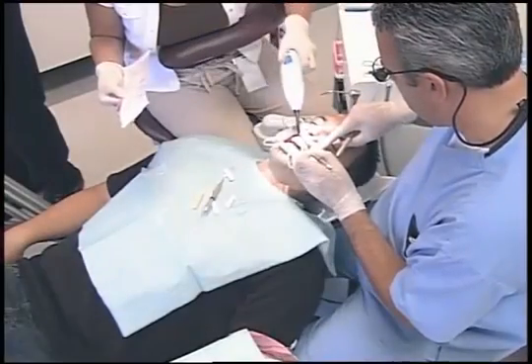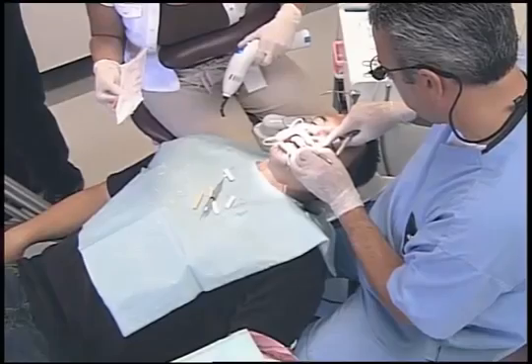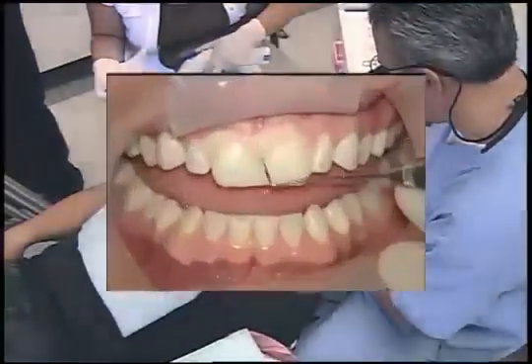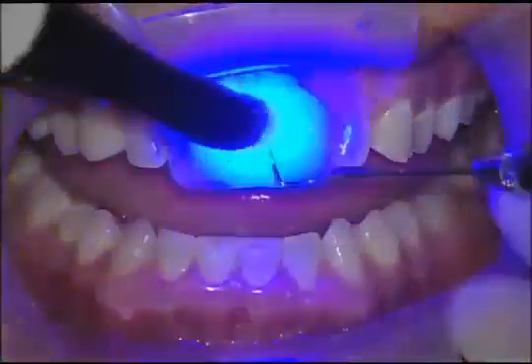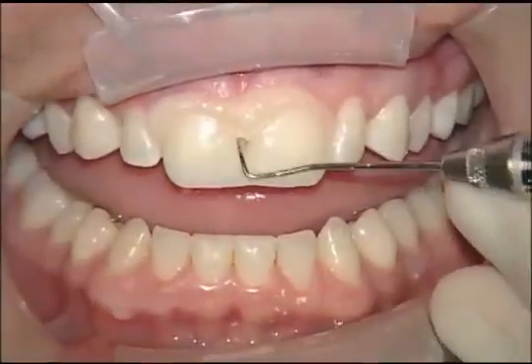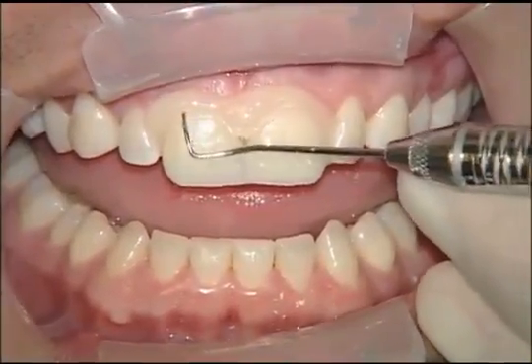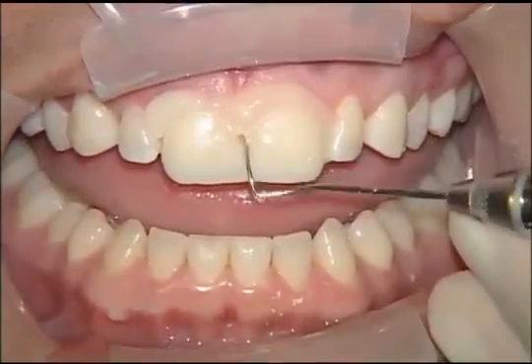So as I put some pressure on these teeth just to make sure they're down all the way, my assistant's going to do a little tack and wave, which is a cure right over, just as you see, two passes there at a couple seconds each. And then I go ahead and judge the viscosity of the cement, and if it's still not set all the way, she'll come back in for another 1.5, 2 second cure. And you can see that as I start to work the Explorer under this material, it has gotten to its gel state, which makes it very easy to clean up at this point.